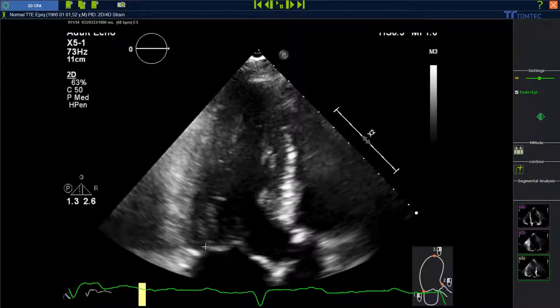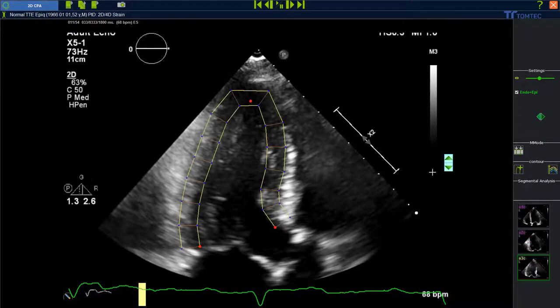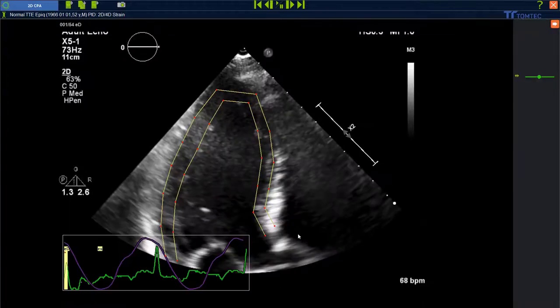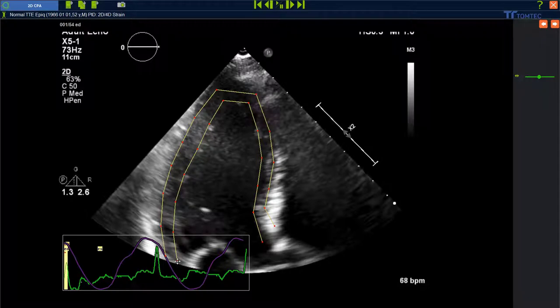Click on the remaining plane and go ahead with the same approach as before. Starting in the end systolic phase, going over and waiting for the end diastolic review, making the adjustments, then accept and go over to the main analysis page.